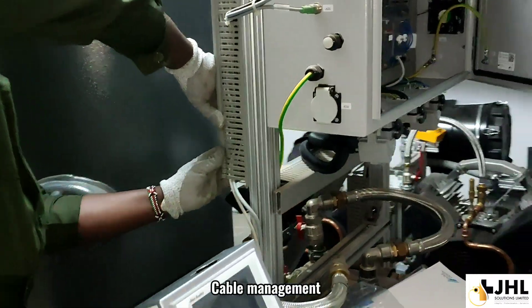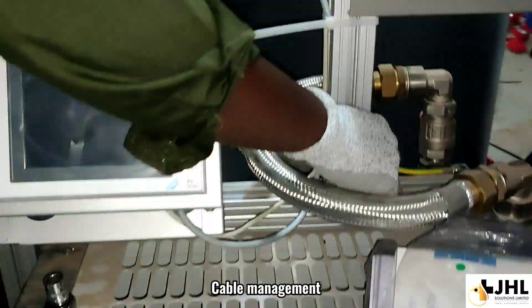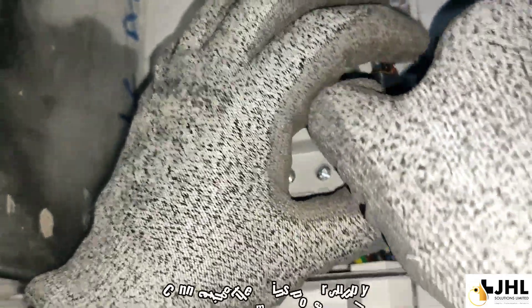Cable management. Securing the unit to the ground and connecting the mains power supply.